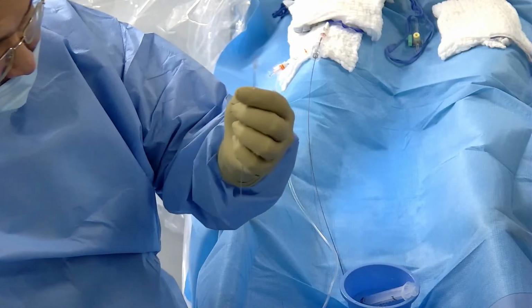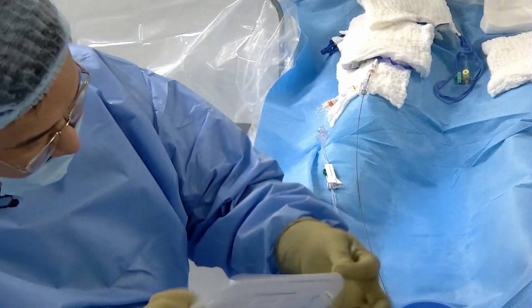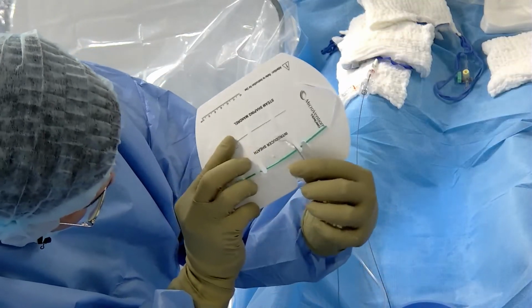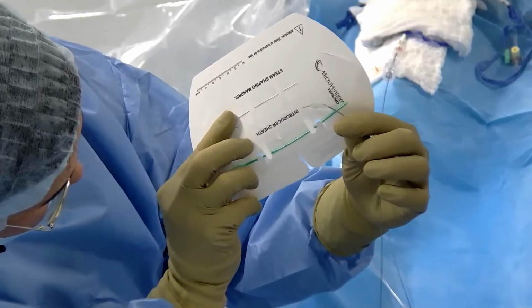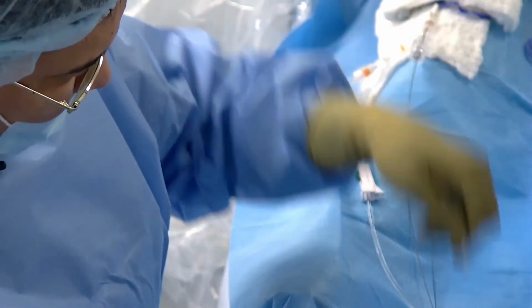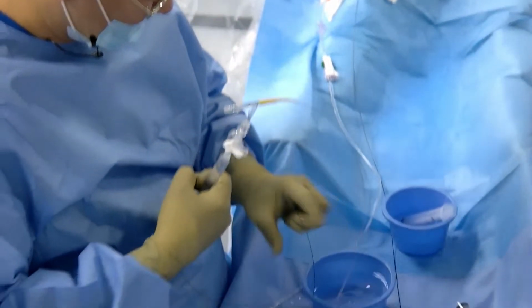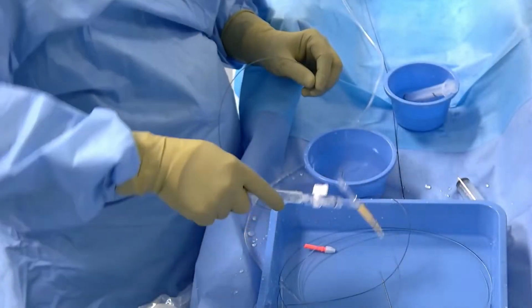And now you can see the balloon looks nice. I hope you can see. Yes, now we inflated the balloon. After the balloon inflation, we put the balloon inside the saline. It's very important during the deflation process.